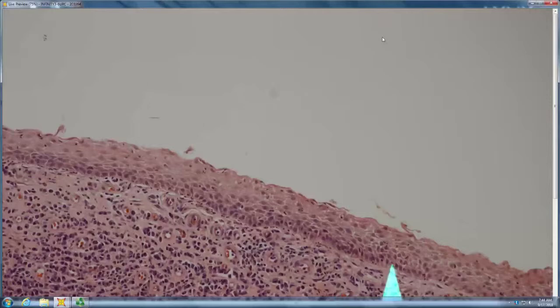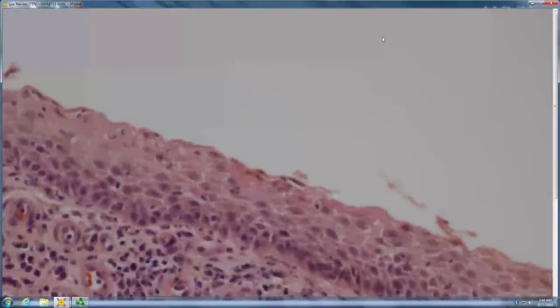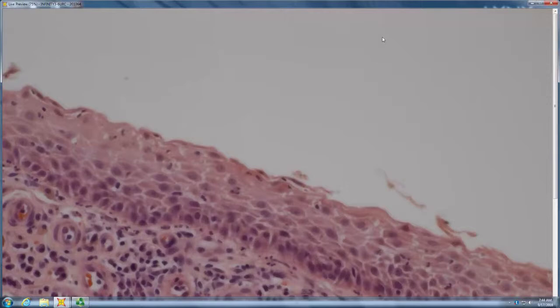Lots of plasma cells. So syphilis should be considered. And diamond-shaped keratinocytes with a little spongiosis in between them. So this is probably Zoon balanitis.